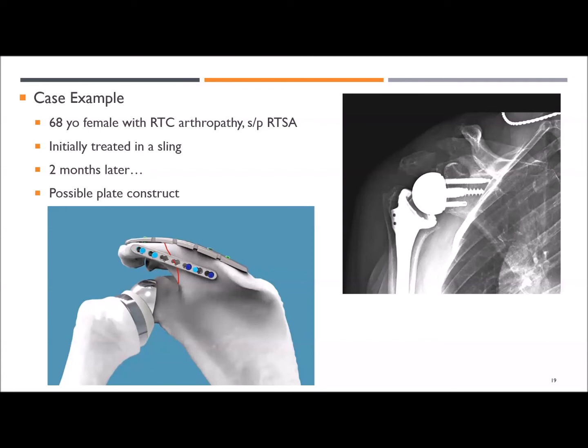But certainly having a fibular strut graft like Bill's talking about is not unreasonable. You might be able to put that posteriorly there under that second straight plate, contour the ends of it a little bit down, have a burr ready. Might have to bend that plate a little bit, and you can wrap the plate right over top of the graft across your fracture site just for more fixation if you need it. But try the Acumed plate, but definitely counsel this patient that there's high risk for this to not go well.